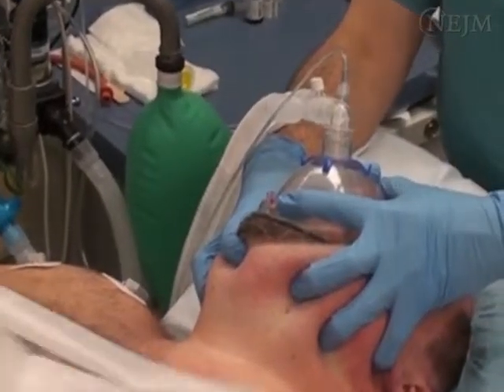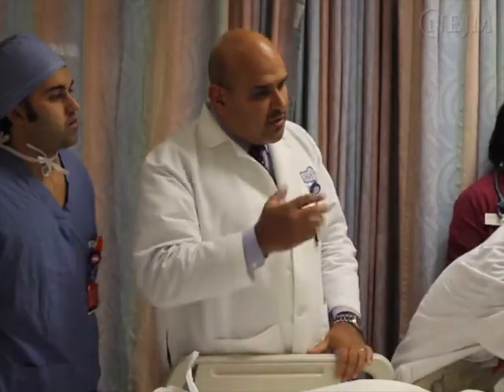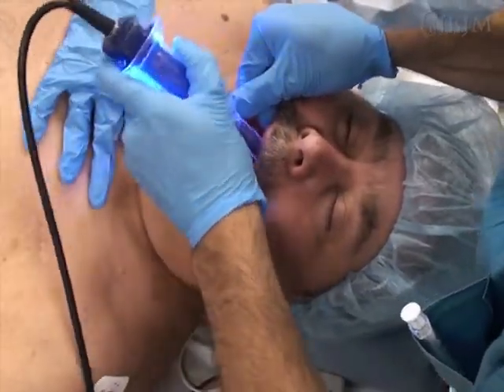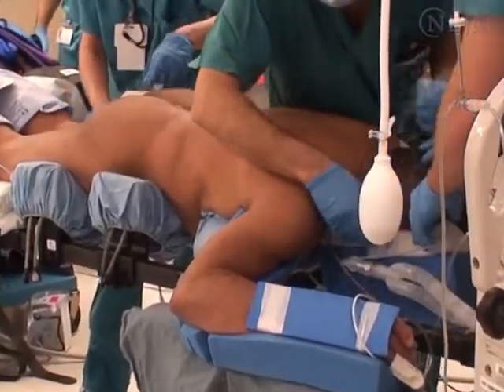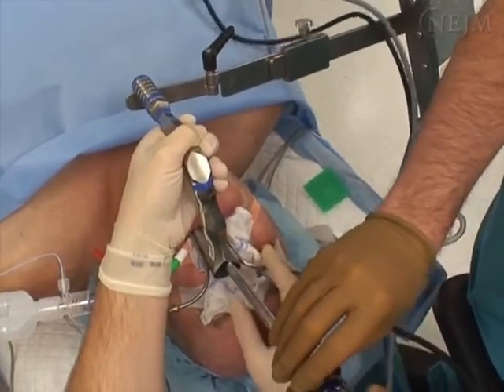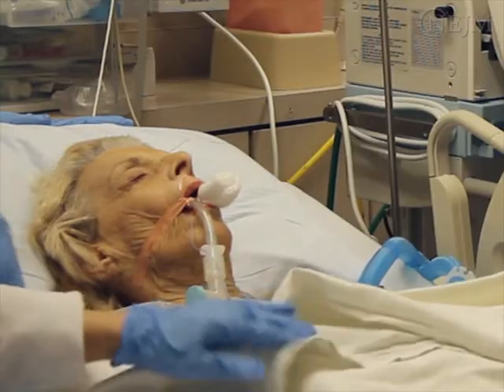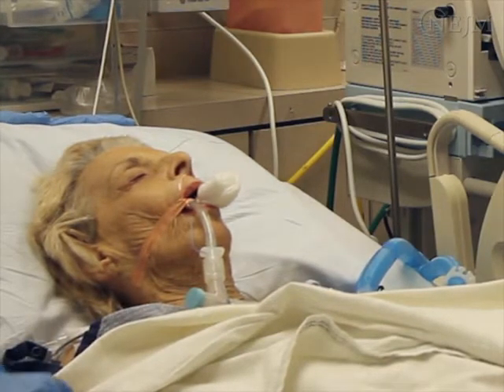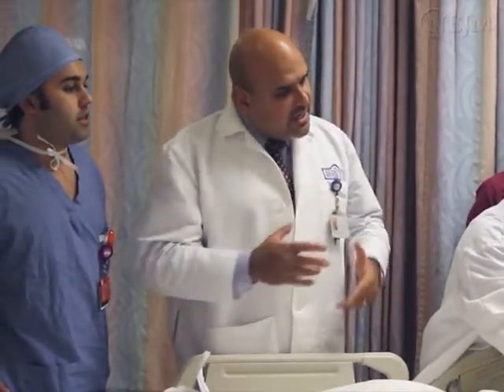When you have had difficulty in ventilating a patient through a face mask or intubating a patient, special consideration is required prior to extubation, because the management of a failed extubation can be extremely challenging. Surgical factors such as the need for a patient to spend a long time in the prone position or the need for direct surgical manipulation of the airway, and medical factors such as angioedema, may increase the difficulty of airway ventilation or intubation. If continued intubation is deemed safer, adequate sedation and cardiopulmonary monitoring should be maintained. Document the plan and communicate it clearly to the patient's medical team.